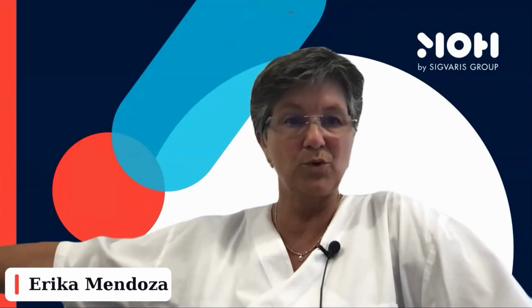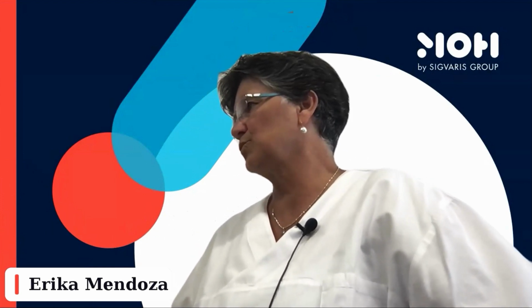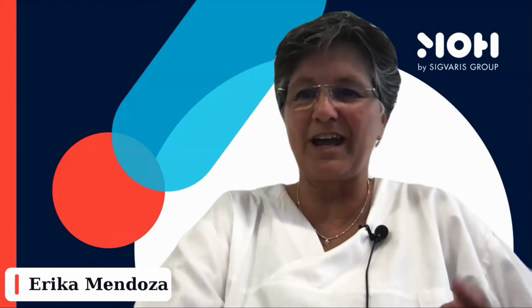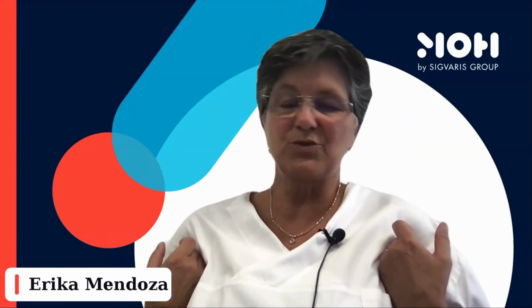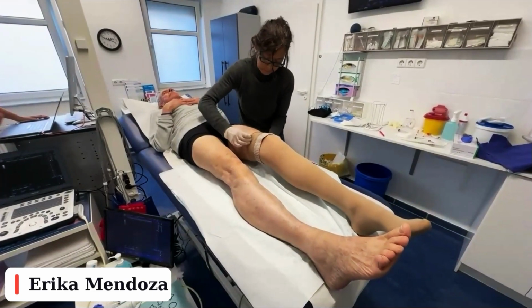And can we put the second mobile just to look, so that you can see the leg. We put compression in the first to the leg, then we put these things in the groin just to extra compress, and he gets a short trouser on it. As to my experience, I'm doing this with the extra trouser when I treat the groin since the year before COVID, so 2019. And my experience is that the results are better when I do recurrent varicose veins in the groin, which this looks like really.